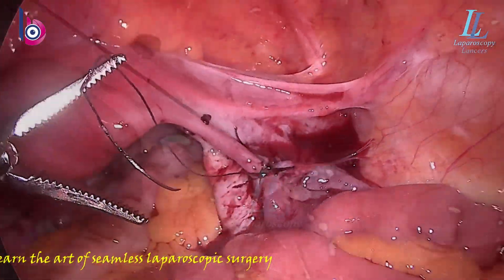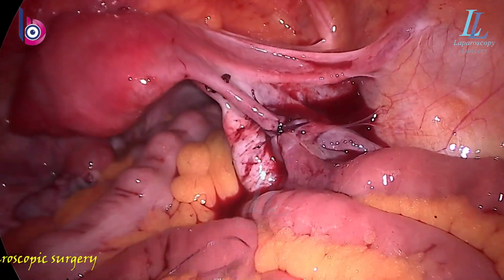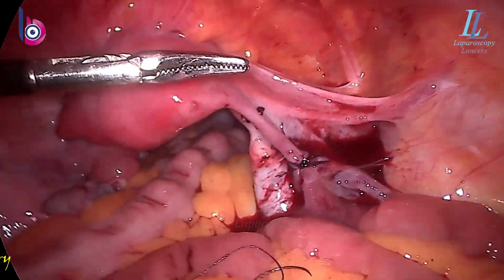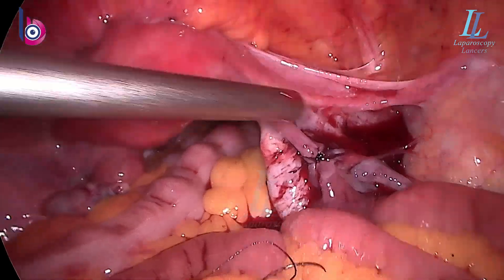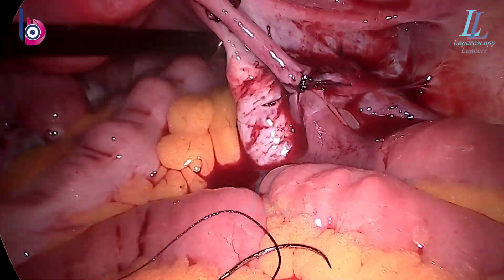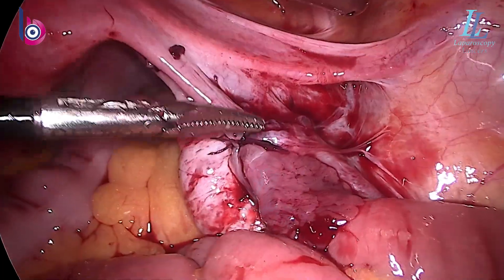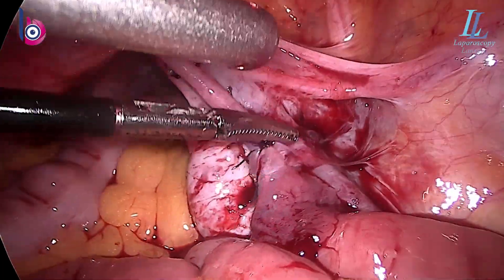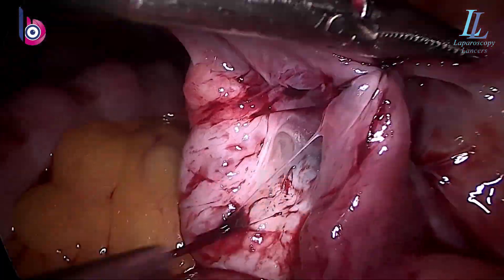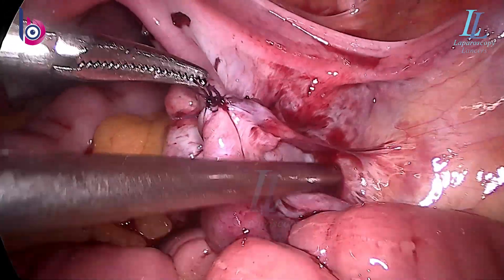We'll hope that the body heals and recanalizes. We will not be testing it with dye again, as every foreign body creates granuloma reactions, and in such traumatized tissues granuloma formation will hinder the anastomotic process — it may join the tube but the mucosal openings will not anastomose nicely. Now coming to the left side — again vasopressin, 5 to 10 ml, which is 20 units in 100 ml, as we use in laparoscopic myomectomy.